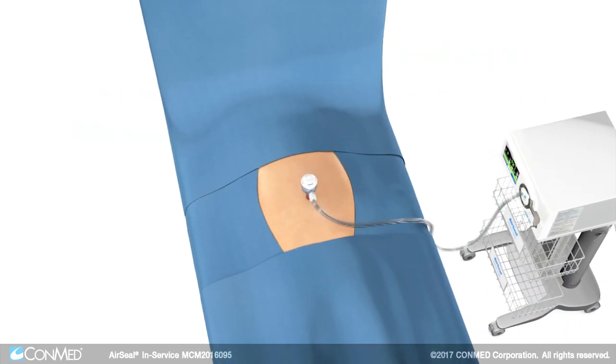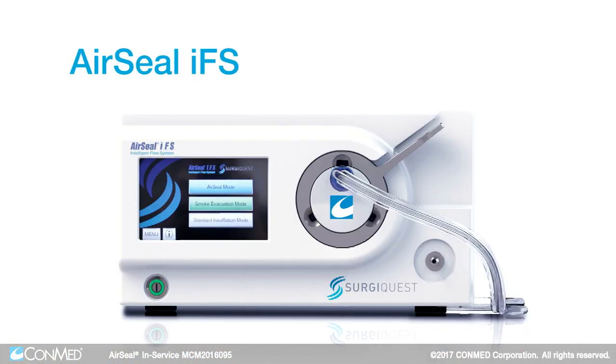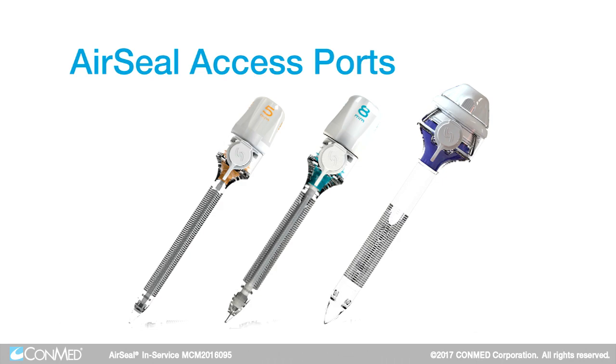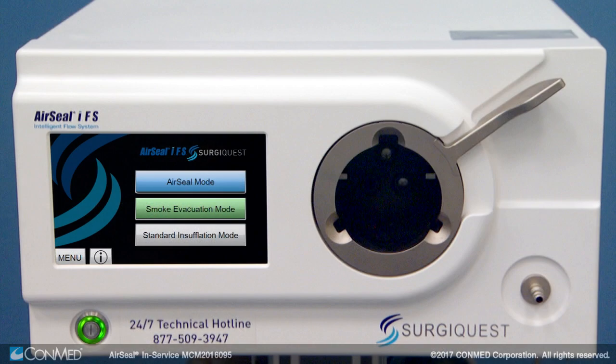The AirSeal system contains three basic components: the IFS unit itself, the AirSeal access ports, and the three filtered tube sets — one for each mode of operation. There are three modes of operation with the AirSeal system: AirSeal mode, smoke evacuation mode, and standard insufflation mode.